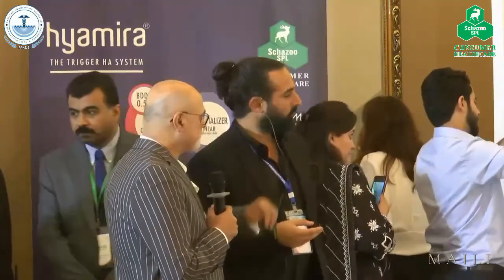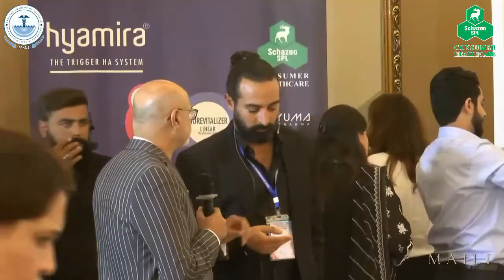Among these MaiLi products, which one is your favorite? It depends on the indication. For the lips, it depends on the lips. In her case, she had pretty much zero lips, so I used Define. For a 20 or 30-year-old girl coming for lips as a fashion statement, I would use Precise. What is the basic difference between these two products? The viscosity. Precise is the most flowy one, then comes Define, then Volume, and Extreme is the most viscous and hard.